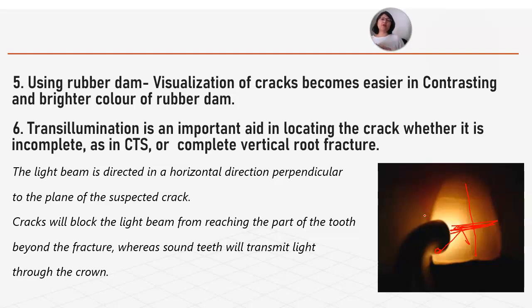You do not need anything. Also, if you want, I can put it in my description box. There is a $10 LED light. I found this on Amazon, and a few friends of mine use that. Again, that is very similar to your curing light, so you can carry it with you anywhere, or keep it in your clinic, and then direct it towards the tooth. But how you direct it matters, right? It has to be perpendicular. So just remember how to do it. And trans-illumination is really a good tool to diagnose a fractured tooth or a cracked tooth.